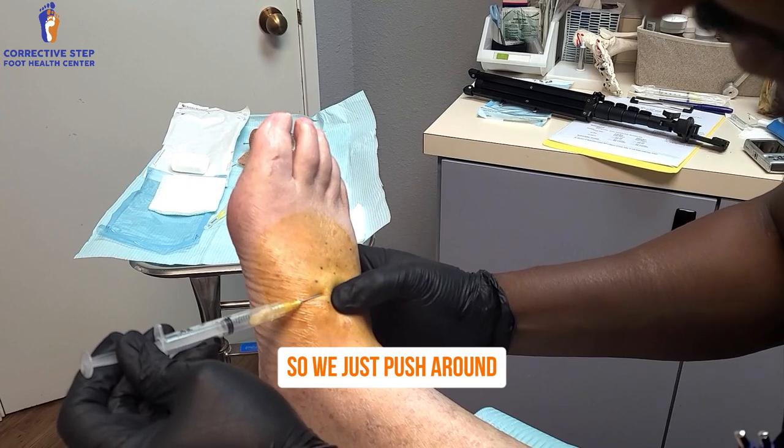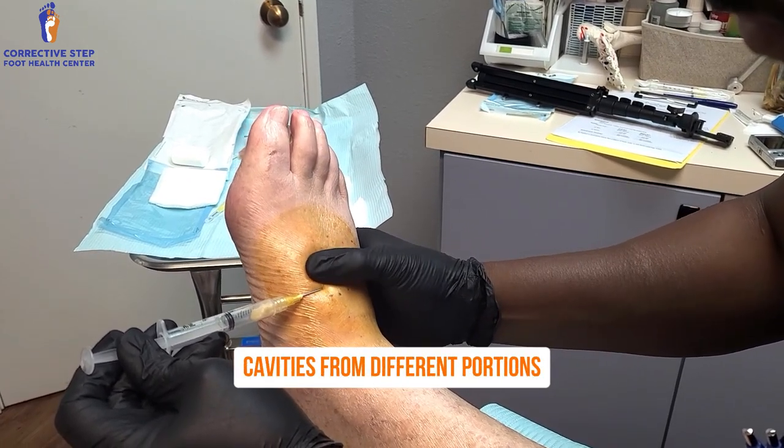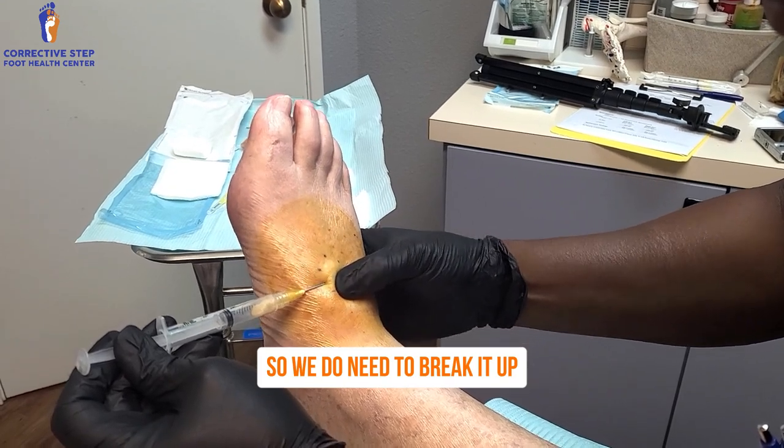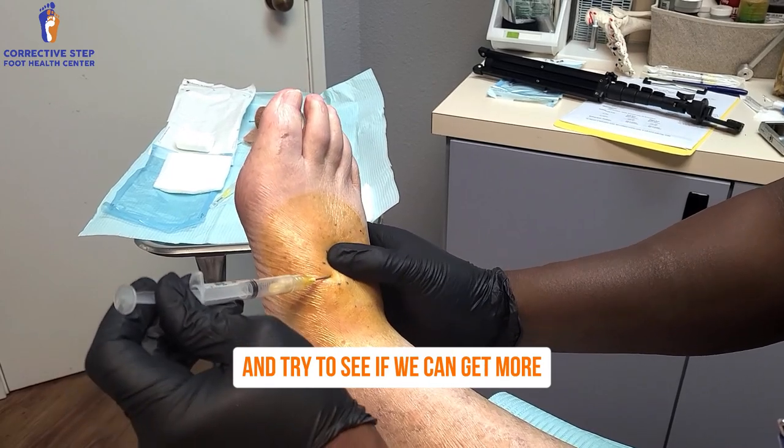So we just push around and see if we can get more. Sometimes the cyst has different cavities and different portions, so we do need to break it up. The patient is good and numb at this point, so we can redirect and try to see if we can get more.